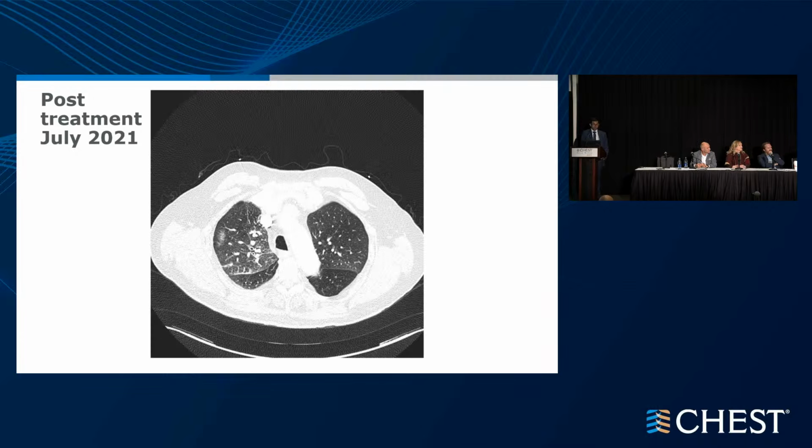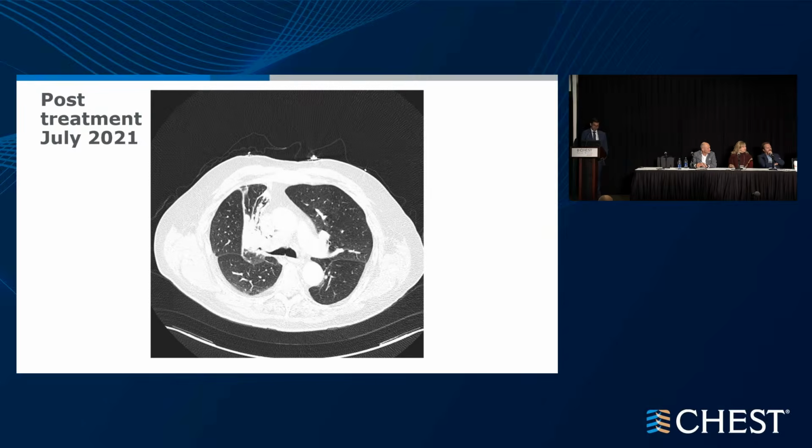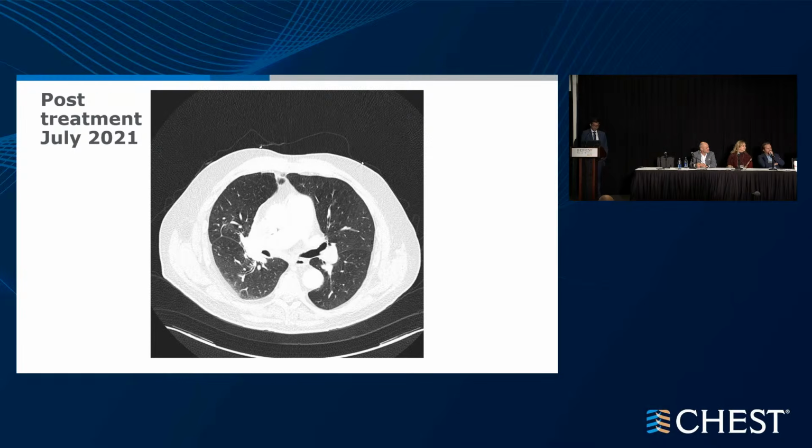And then post-treatment, you could see more upper lobe, there's some stuff there, but it did open up quite a bit more. Some of it, that kind of medial aspect, anterior aspect is gone, I think, and that's been down since April 2020. But you could even see the endoluminal area retracted much more.